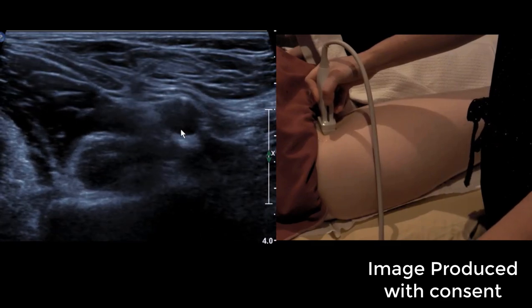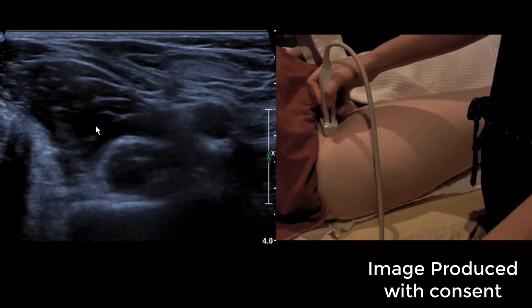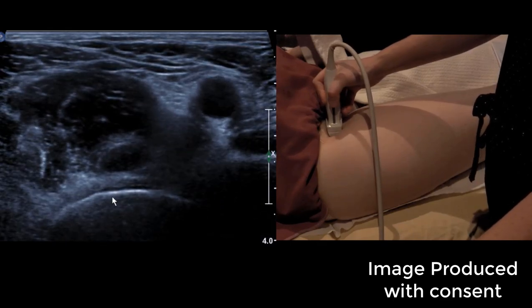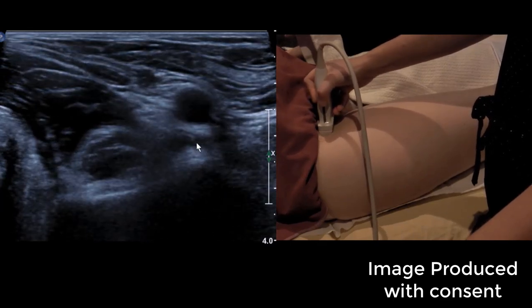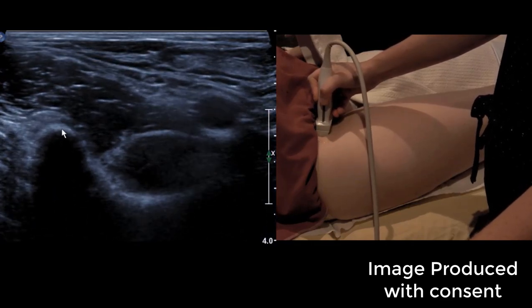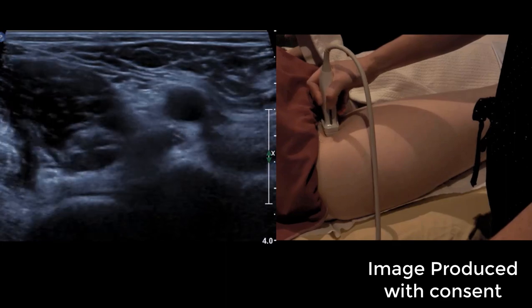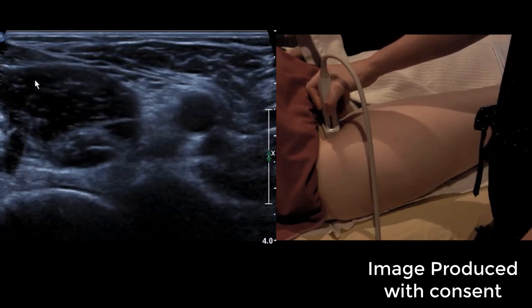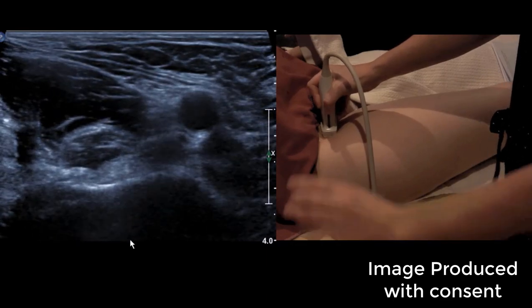So there's the femoral artery, iliacus lateral fibres, iliacus medial fibres. That's too low, that's femoral head. We're going up, there's iliopectineal eminence, and we want to be sort of lower than the AIIS. So this is our starting position, and I'm now putting more pressure on the outside of the camera just to make the tendon nice and bright. So we're ready to go.